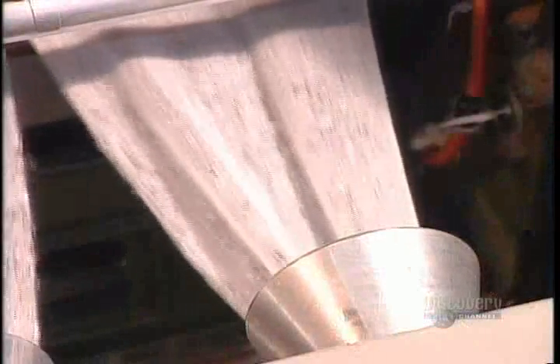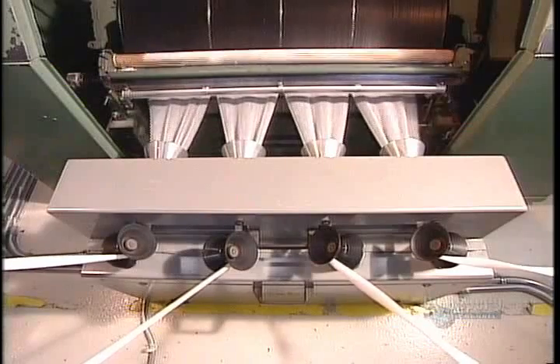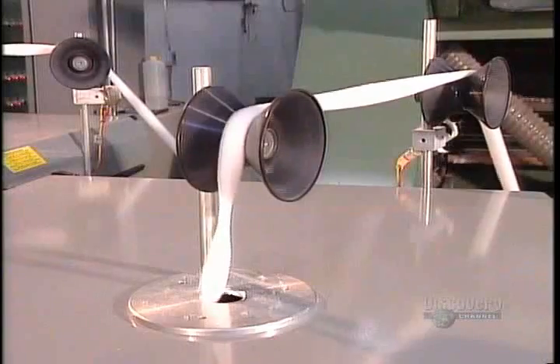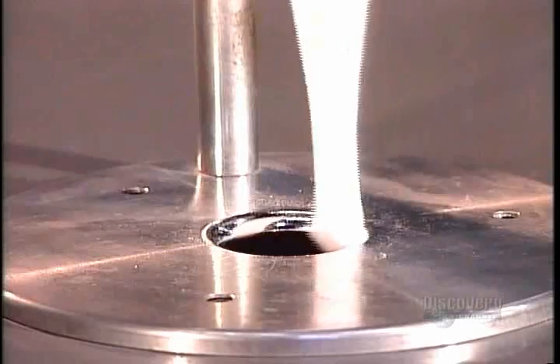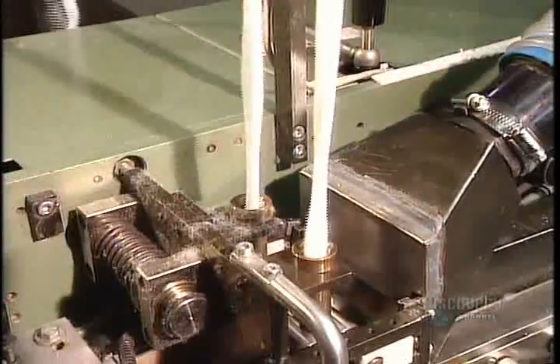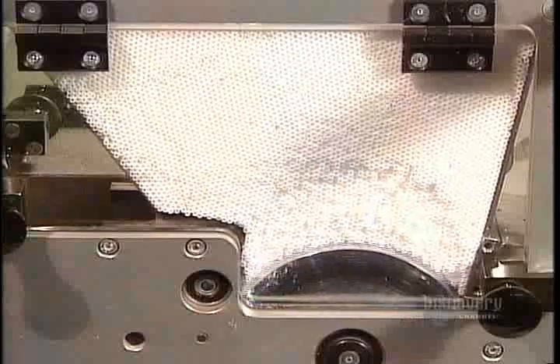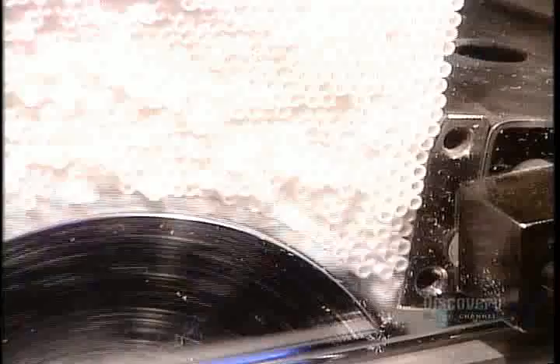To make cotton swabs, the initial web is divided into 4 narrower webs, each weighing 1.5 grams per meter. Each narrow web travels through a funnel, which transforms its shape from flat to round. Then it coils into a barrel. The swab-making machine then takes the cotton strands from 2 barrels at a time, feeding a line of cotton to each end of the stick. Like the cosmetic pads, the amount of cotton per stick varies according to the client's specifications.